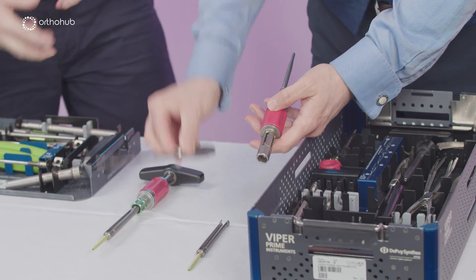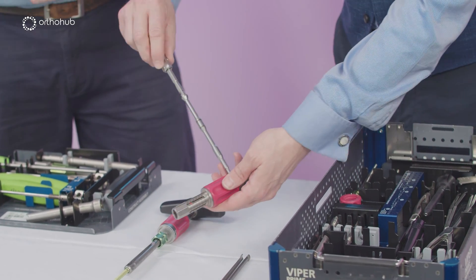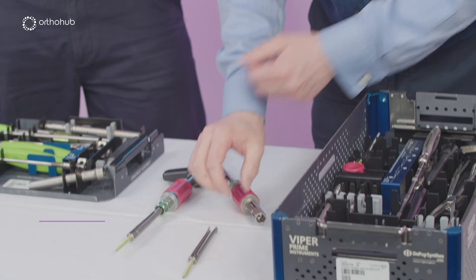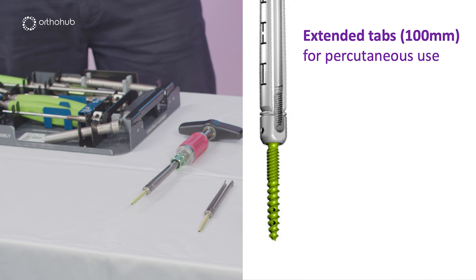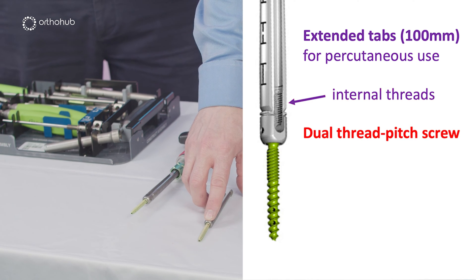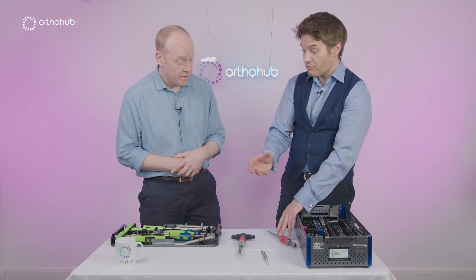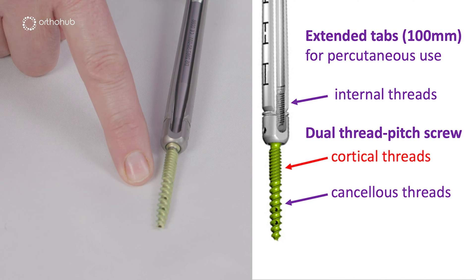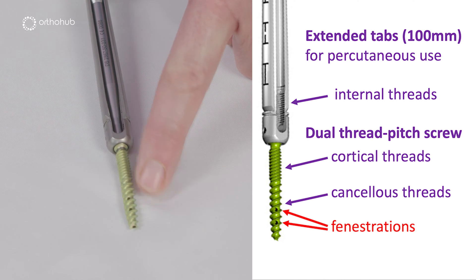This tool is extremely useful — it's the locking nut applicator, the final tightener, a universal screwdriver. There's our screwdriver missing the screw. Here is the screw we're going to attach to it. The features worth pointing out: extended tabs with threads inside, which allow us to reduce with ease and a huge amount of strength. The screw has two different thread sizes, which increases pull-out strength — a widely pitched thread into the cancellous part inside the body, and dense threads for the pedicle.